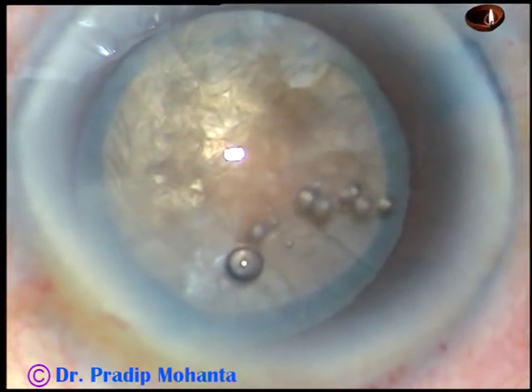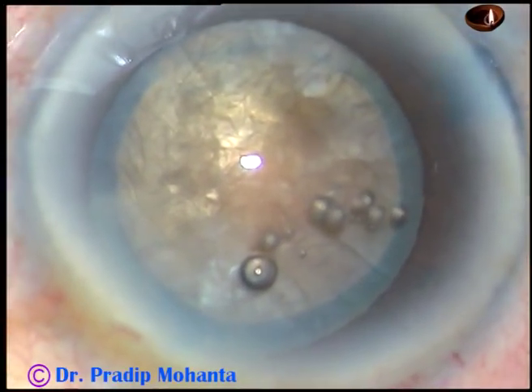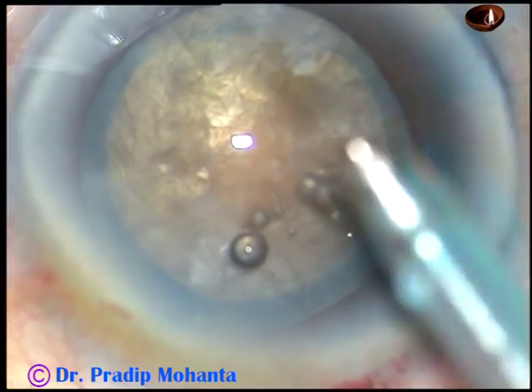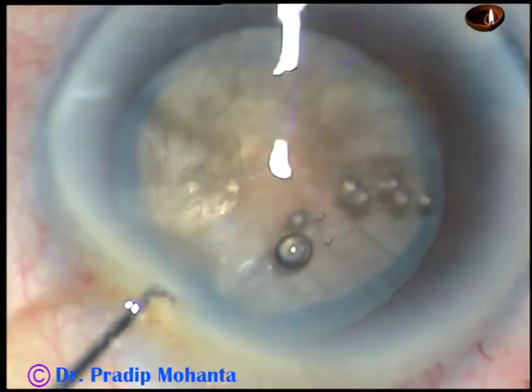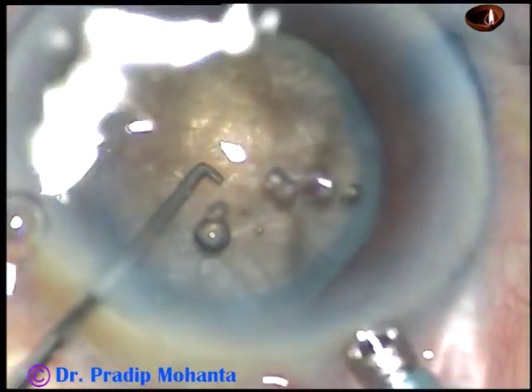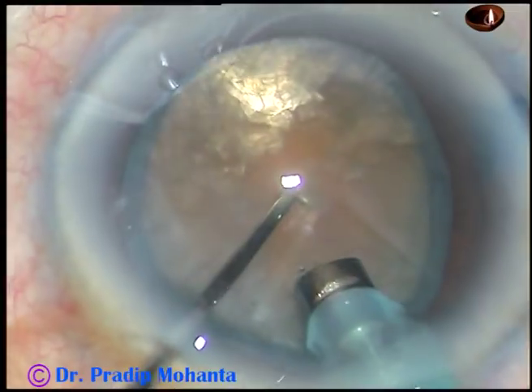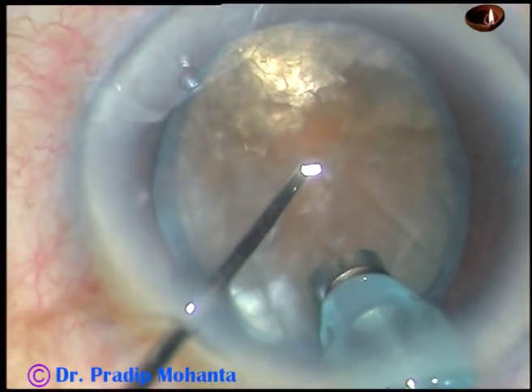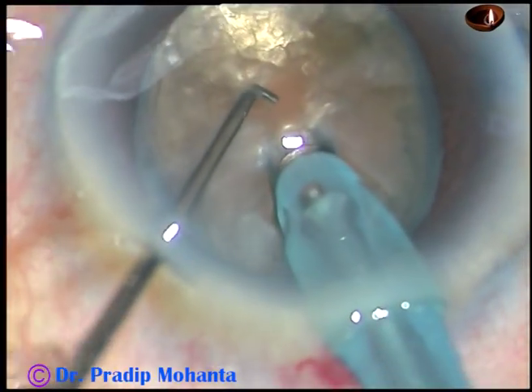Now is the time to manage this nucleus. The machine being used is Oertli Catarhex 3. I am in MICS mode from the very beginning and going with very high vacuum — 450 mmHg vacuum and 40 ml per minute flow rate. The ultrasonic power being used is about 80%.